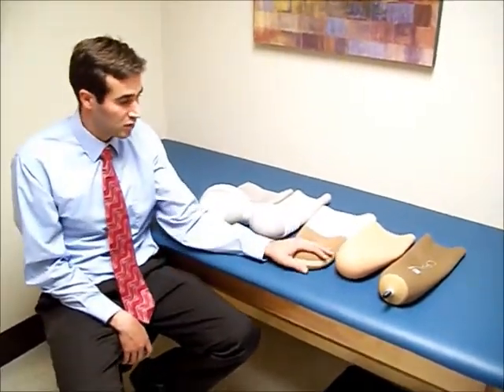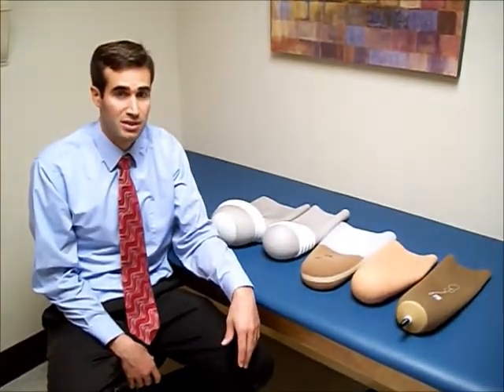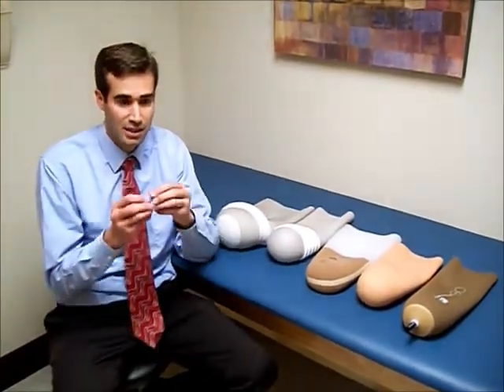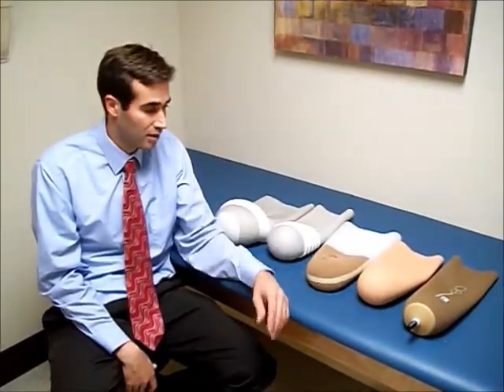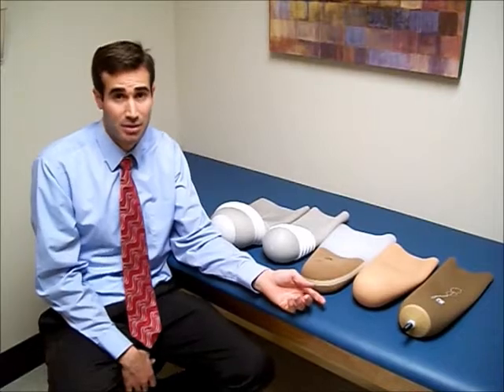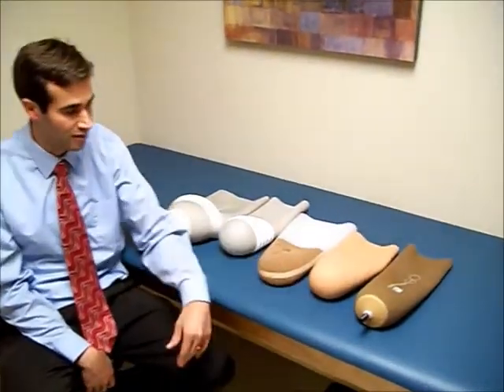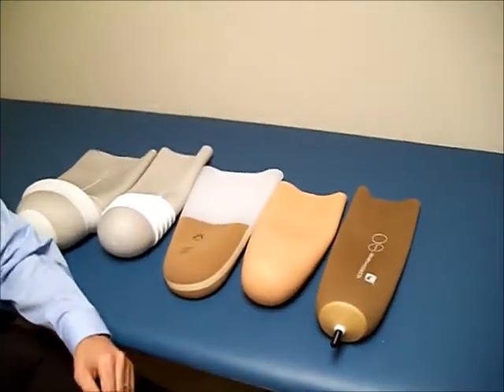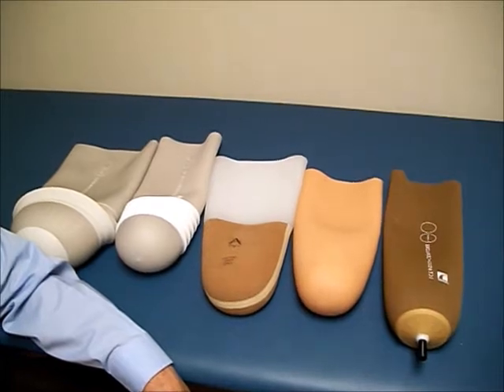For a vacuum socket, urethane is the most common material used because it flows under vacuum — meaning it will move around the bony prominences — and the urethane gel does that best. There are some new silicone designs that can flow as well, but many people in the field still feel the urethane is the best.